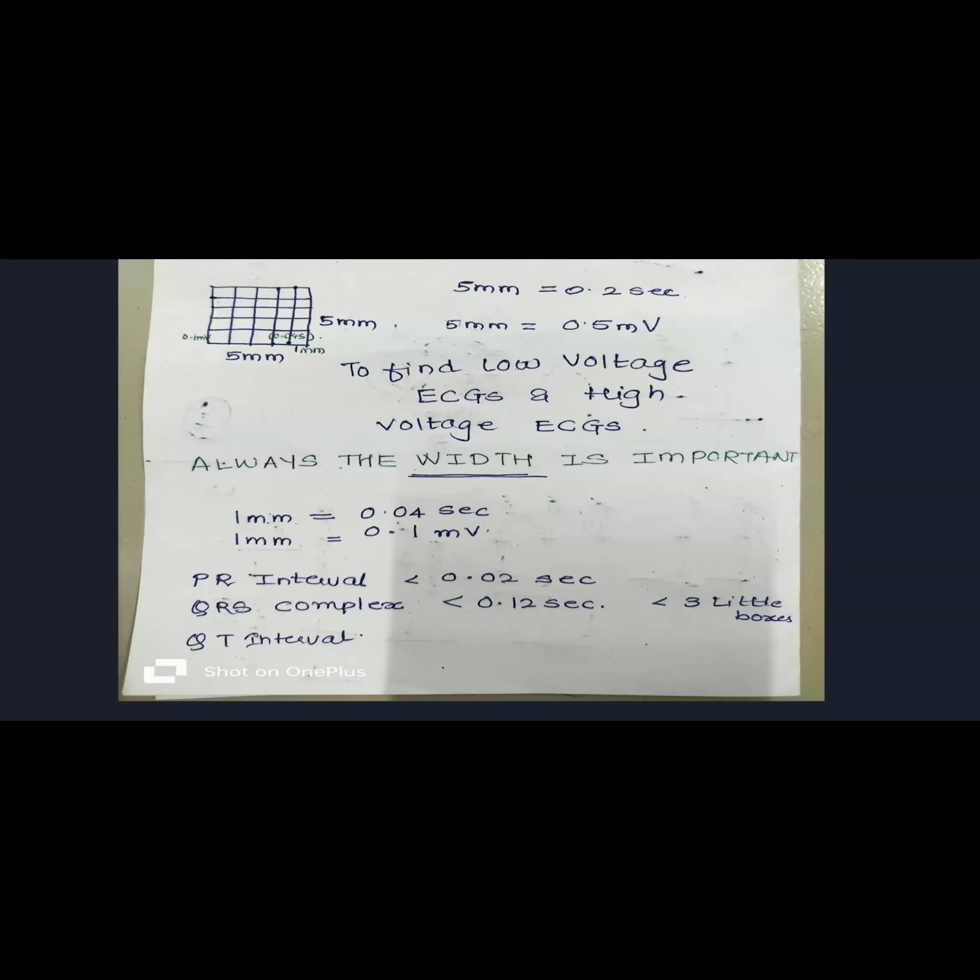If it is not possible to calculate with 300 divided by the number of large boxes, then you take 1500 in the numerator and divide it by the number of small boxes between the RR interval. How is this done? I'll be explaining it in the next lecture, because the next lecture is a bit tricky and I hope maximum number of students will be joining it, because we'll be studying myocardial infarct.